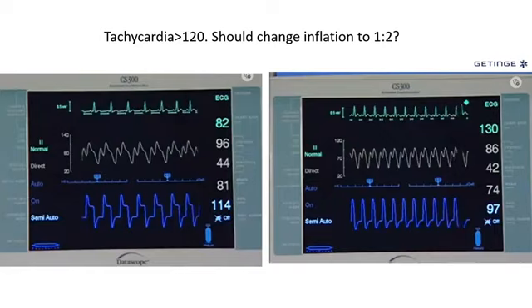So a reduction in stroke volume will reduce the capacity to augment. That's actually one reason in general why the very, very depressed ventricle with very low stroke volume may not augment properly with balloon pump. Now, another idea with tachycardia is that you get less diastolic time. Therefore, you get less time for the balloon pump to displace the blood volume in diastole, and therefore you get less diastolic augmentation. You have less time for that augmentation to rise furthermore. You get less augmentation, and therefore you get less vacuum upon deflation and less reduction in afterload. Okay, so that's why you get less augmentation with tachycardia.